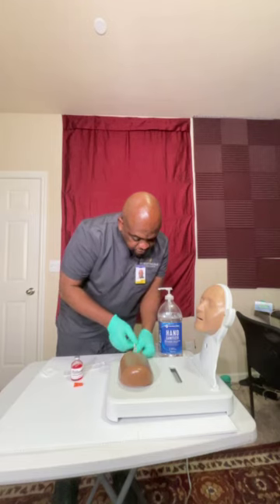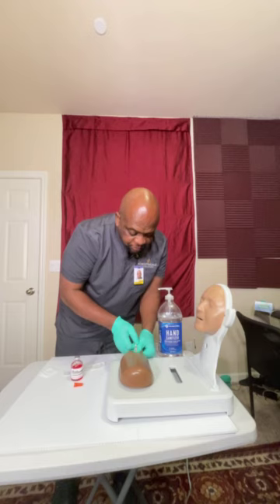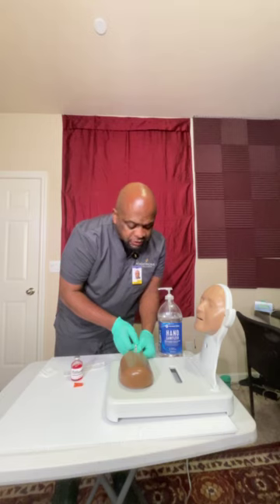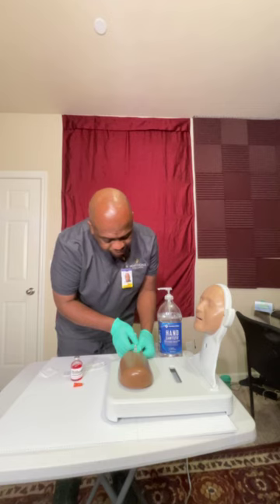And there's a little bulb. Of course, I would explain to the patient before I even poke him that he will feel a biting sensation, like a little insect bite. It will feel like when it gets poked. And Mr. Jones is going to remind you that that's what you're feeling right now. As I mentioned earlier, that's what I have done.